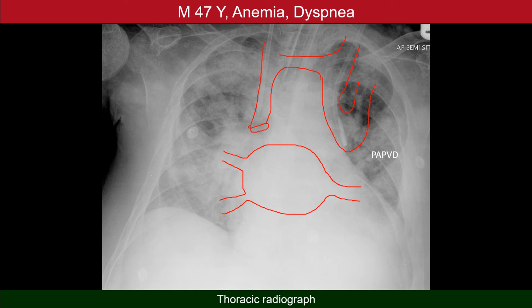So in this case of left-sided cardiac decompensation, the high pressure will be reflected on all parts of the lung, except of course the left upper lobe, which will not suffer this high pressure because it is draining simply somewhere else.